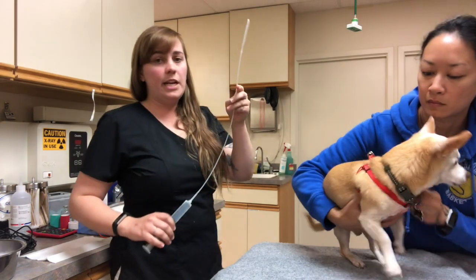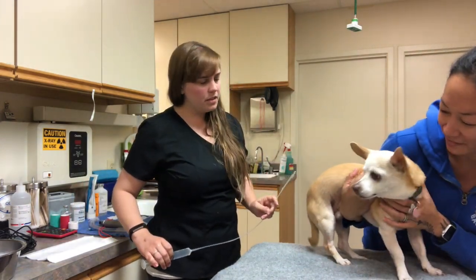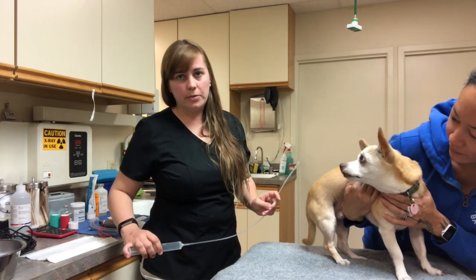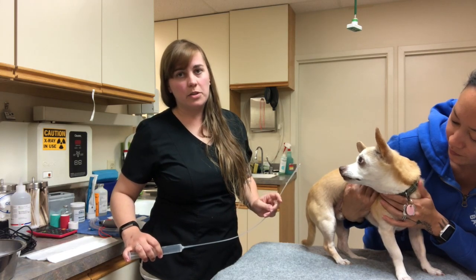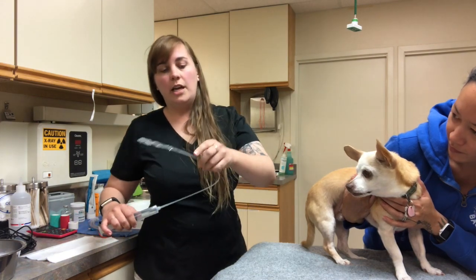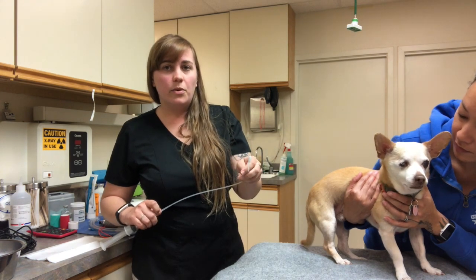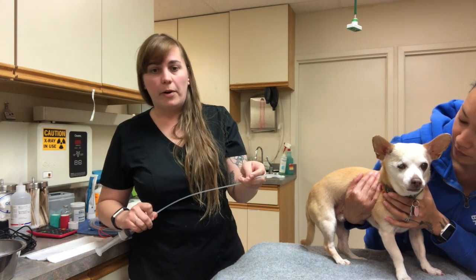And then when we're ready, this is when you would insert it into the rectum a little ways, administer your fluid depending on what the doctor wants, how much they want to administer. Slowly take out your catheter and then place your patient in the kennel, and hopefully they're going to defecate. If they don't, you can repeat the process in about an hour.